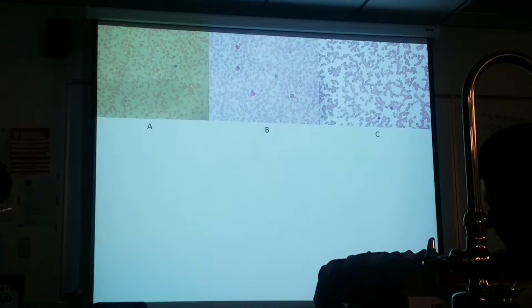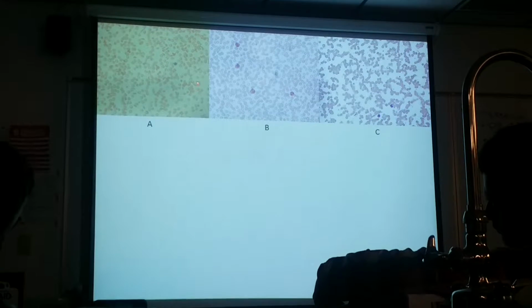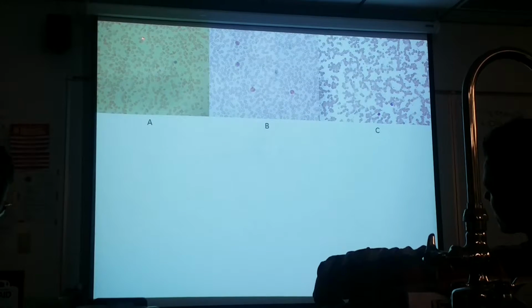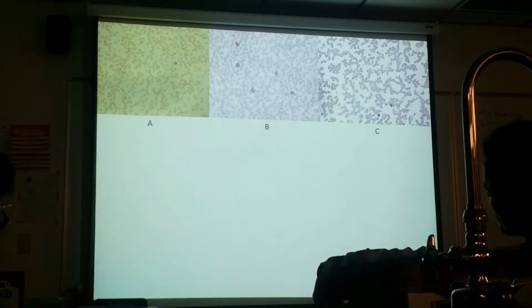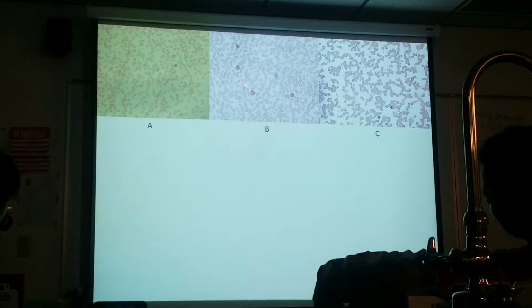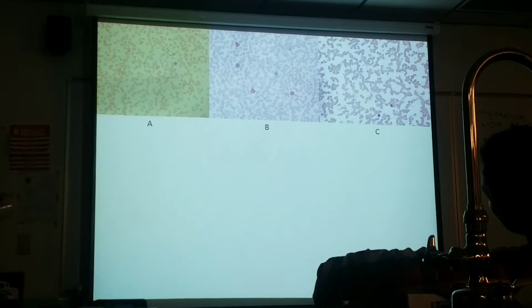Okay, so those are different blood conditions. 2 of them are anemias. Once again, sickle cell anemia. If you look closely, look for some of the cells to be puckered or sickled. I may even have you identify a sickled cell. Whereas in C, what we saw was the microcytes. That's kind of what I look for when I distinguish the anemias. And for the eosinophilia, look for a lot of eosinophils. You usually don't see more than one in the same view.